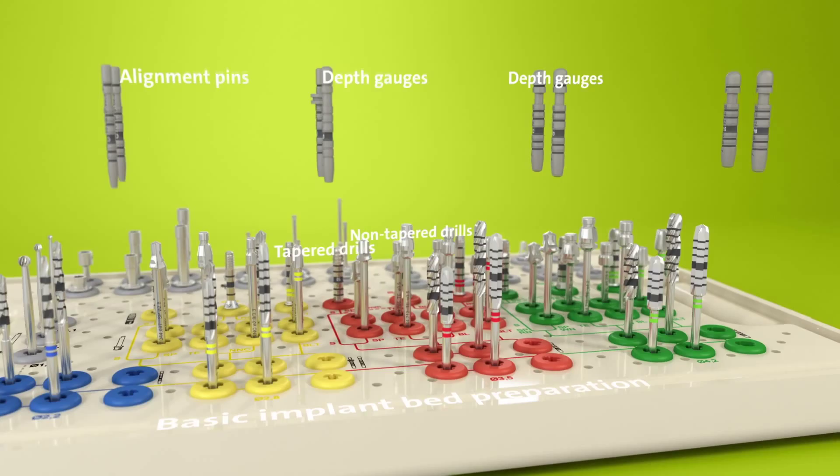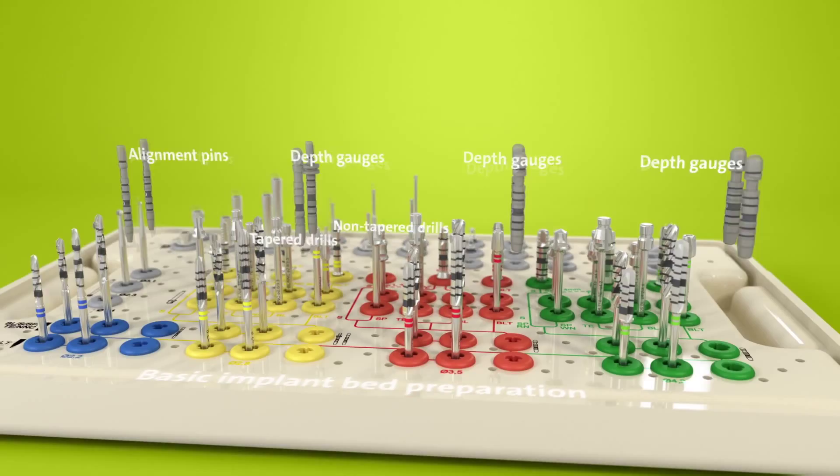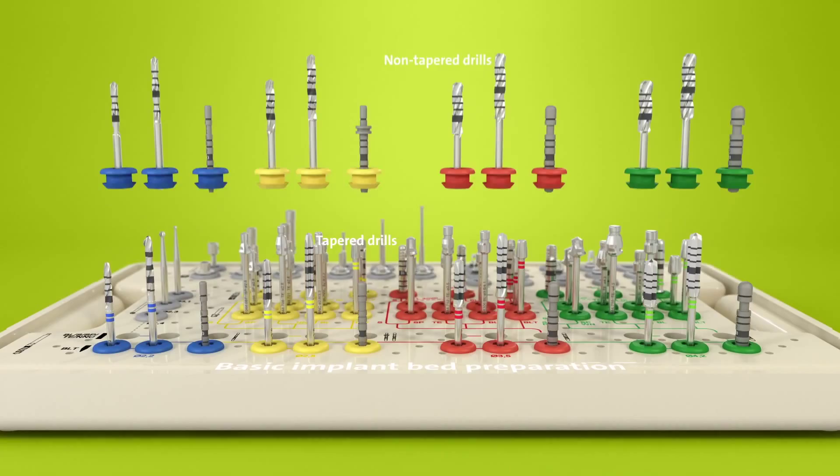Alignment pins and depth gauges for checking the accuracy of the basic implant bed preparation are also located in this area. The same pins and gauges can be used with both tapered and non-tapered drills.